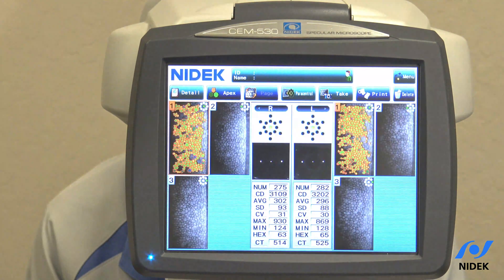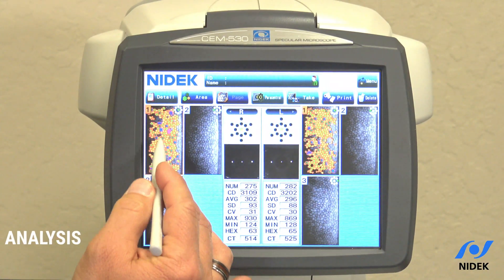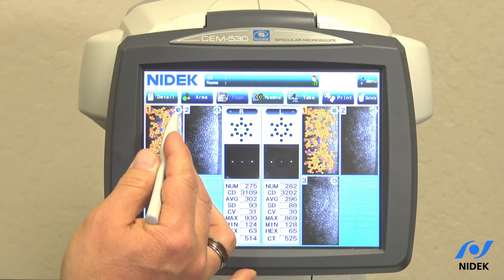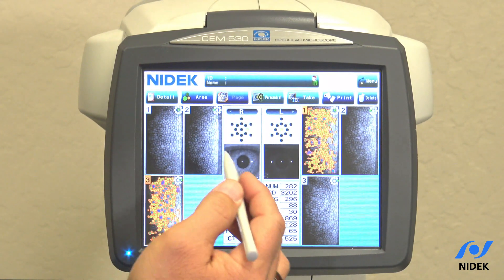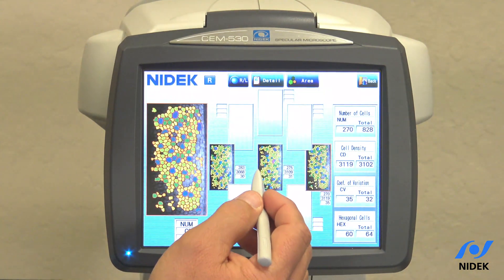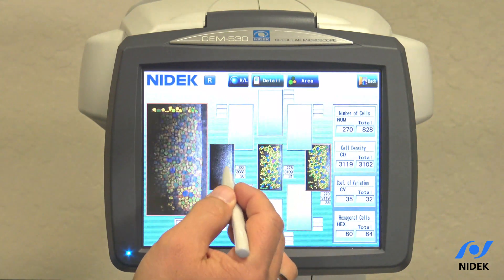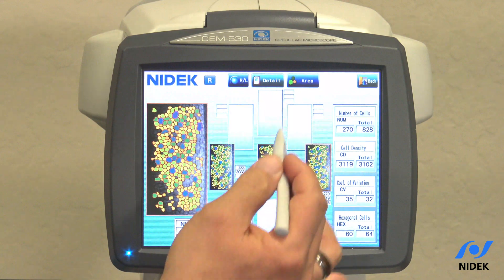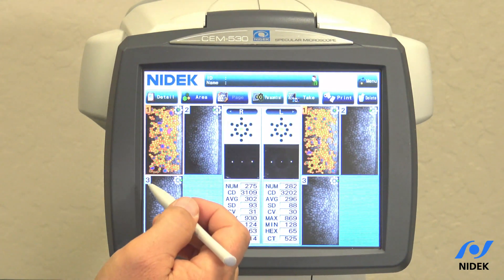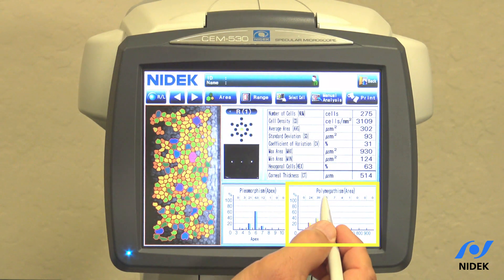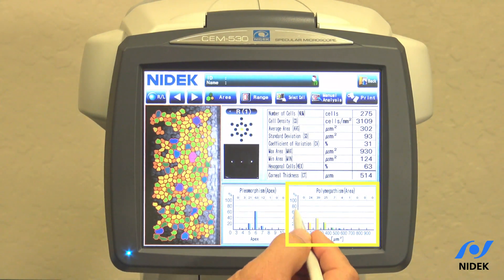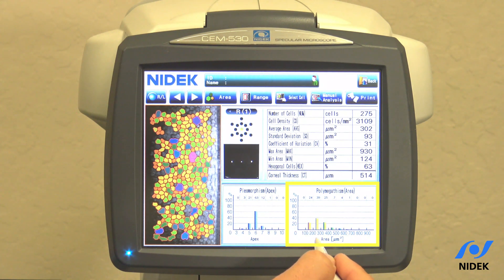Now we're going to go into our results. In the analyze results screen, on the right eye you can see the three images that were taken: central, paracentral, paracentral. You can see the green dot here. In paracentral mode, this shows our center and paracentral imaging. Each one of these can be viewed on the left. If you select an image and click details, you can see it is color-coded — this area is our polymegathism area, color-coded by the percentage of cells determined by their size.